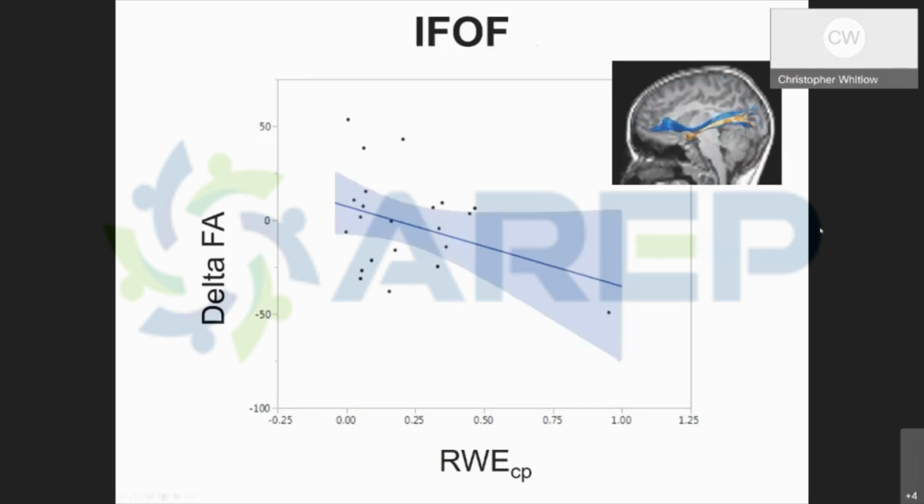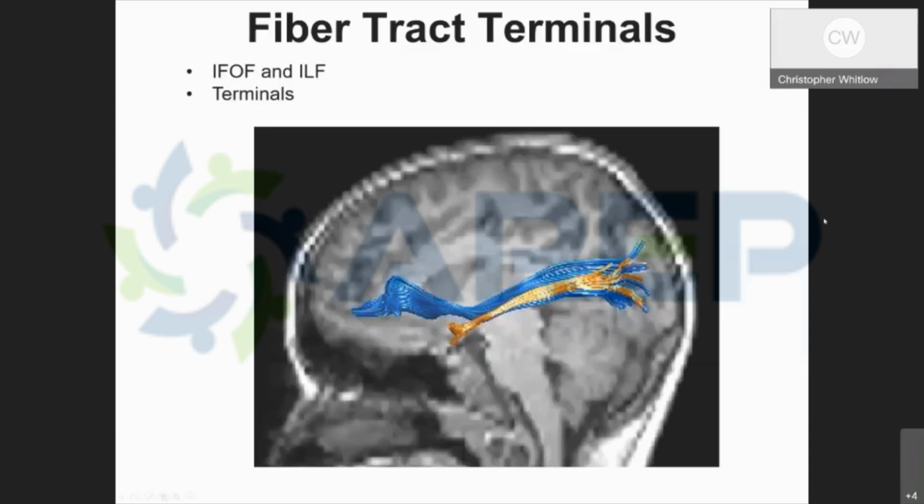And this was also true for the inferior fronto-occipital fasciculus, and it's interesting because it connects portions of frontal, occipital, and temporal lobes. And of course, we're concerned about ultimate downstream effects and function of those regions. I also wondered if these changes would be more pronounced at the gray-white junction, where material properties change and where we see injuries clinically after high velocity impacts, like so-called diffuse axonal injuries, right there.